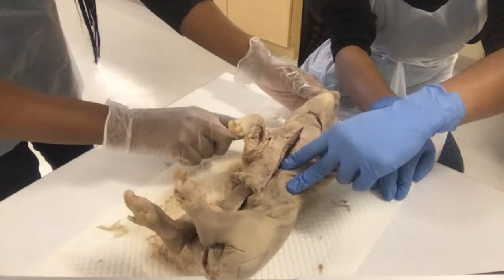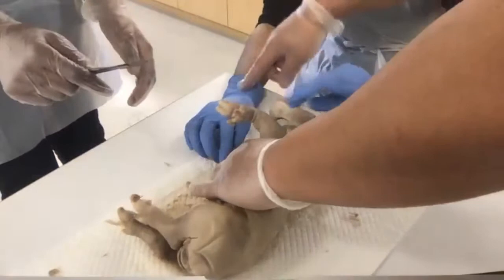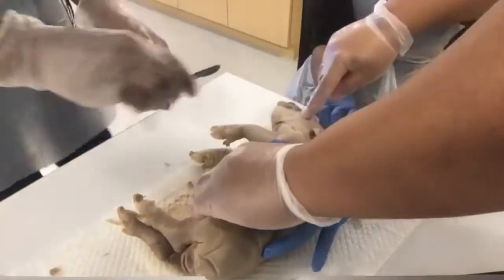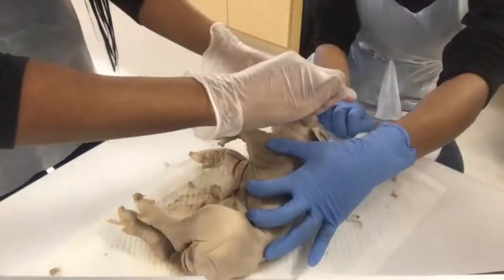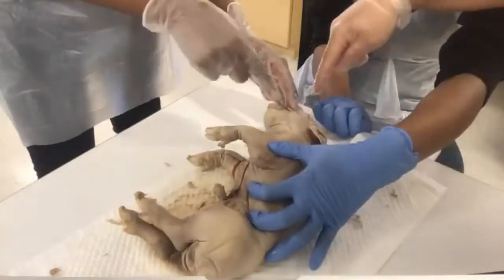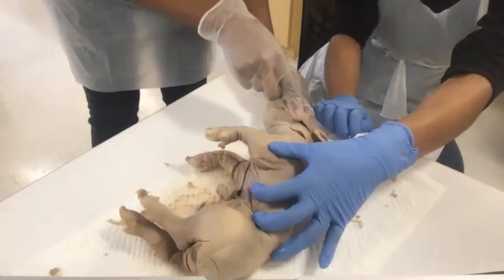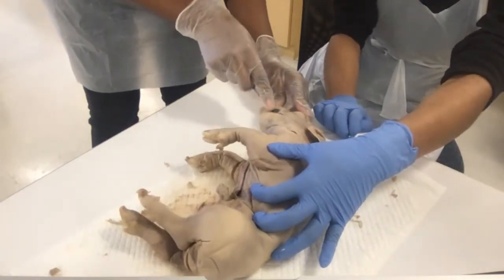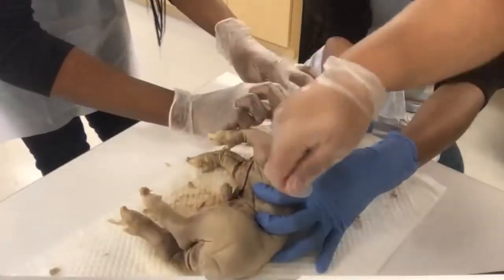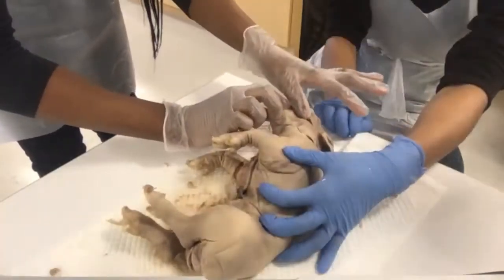Okay, good. And then you could lay Piggy on the side like this and then do the same. Well, you can just hold Piggy right here, just get this out of the way, and do the same thing here, cut from here to here. From here to here. Well, cut the different direction, because if you cut like this and you slip, boop, right? So you could also see how the surgeon also has to be cognizant of where the assist is, right? Where your nurses are, where everyone is, right? And you notice when she cut, did she cut like that? She cut with a purpose, centimeter by centimeter.